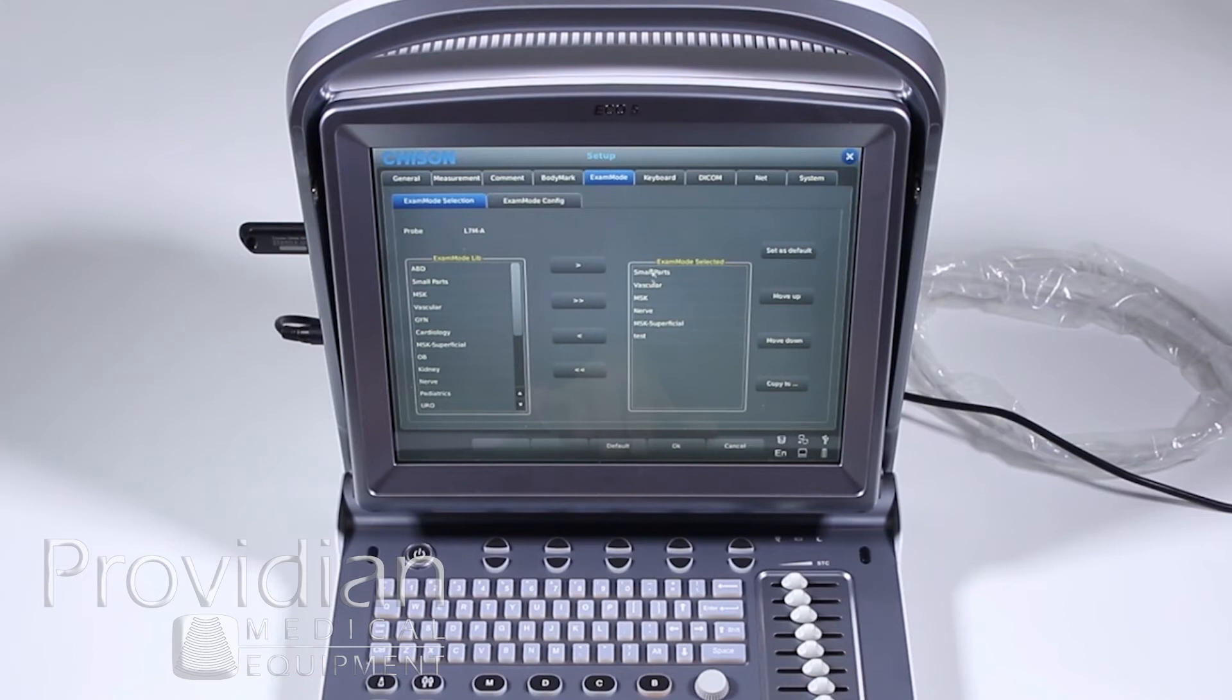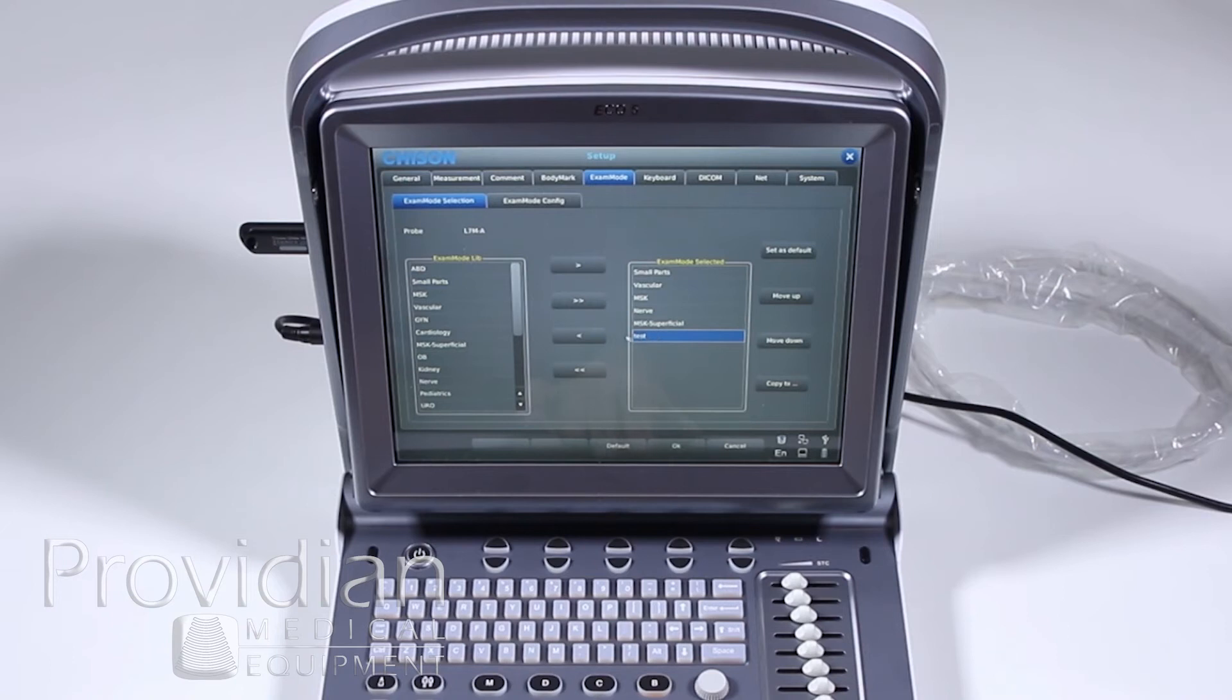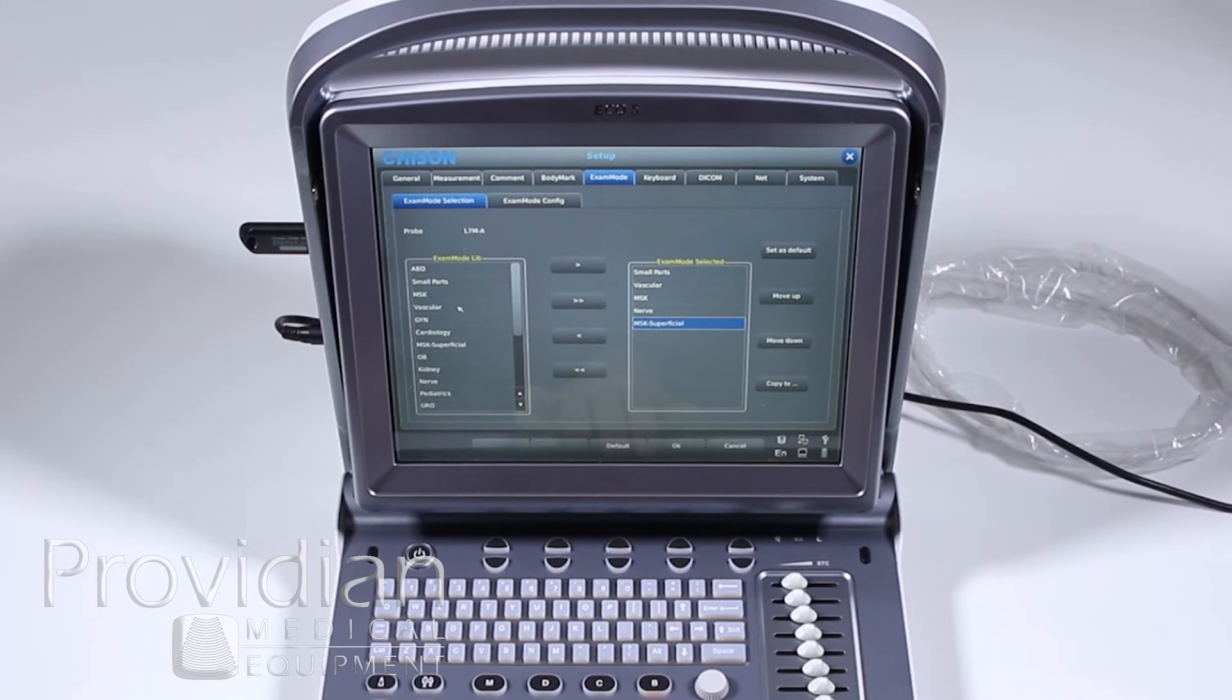They've preset it to these five, and of course I added my own here. And if I don't want that one anymore, which I don't want, I'm just going to go ahead and move it out of there. So it's gone. But say I want to add a GYN, which I wouldn't, but for this purpose, I could just click it over there.